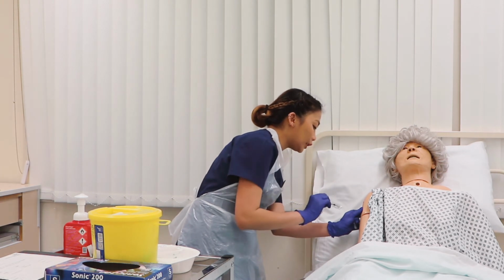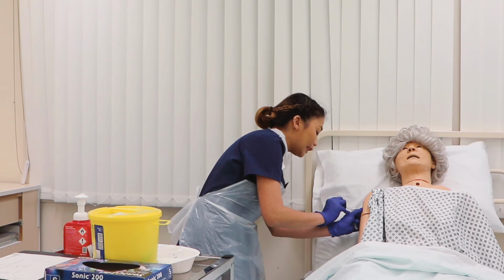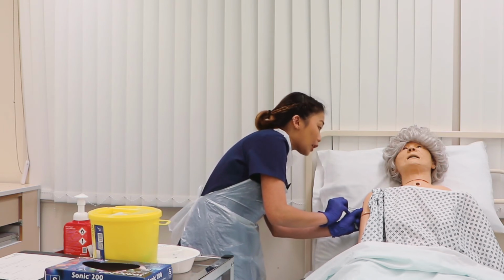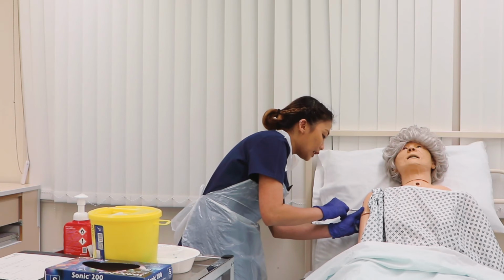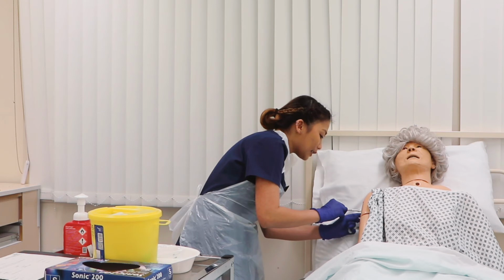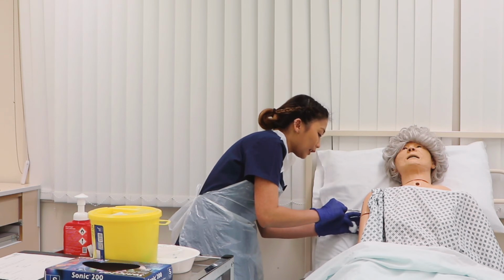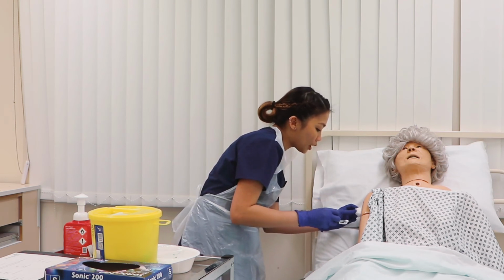I'm giving the injection in a dart-like manner at 90 degrees because I'm giving insulin using an insulin syringe. Sharp scratch coming. Injecting it. Releasing the pinch. And administering the medication for 10 to 30 seconds. 1, 2, 3, 4, 5, 6, 7, 8, 9, 10. Rapidly withdrawing it. Putting the cotton balls, applying gentle pressure but not massaging the area.